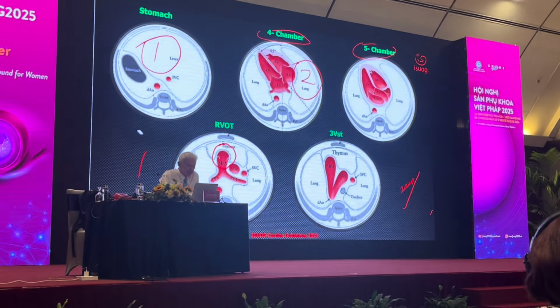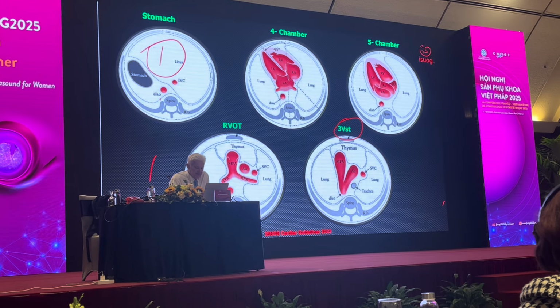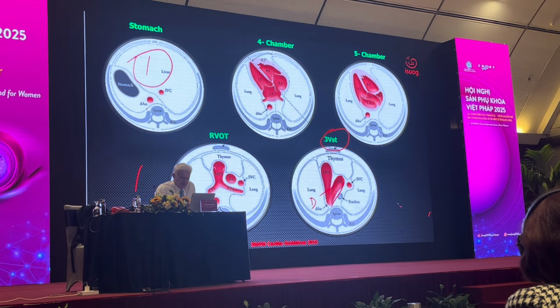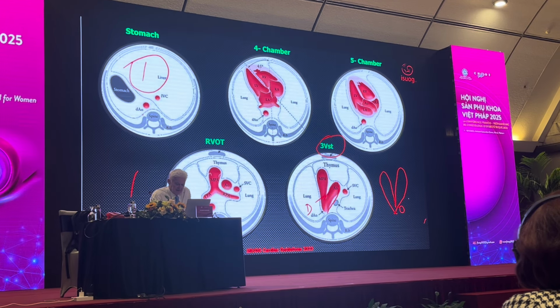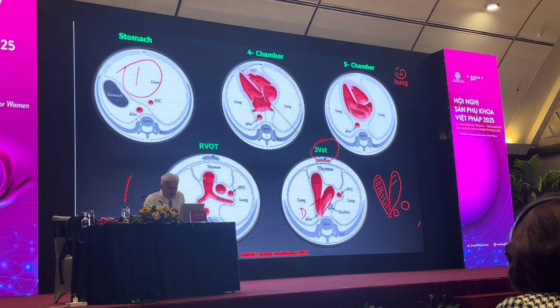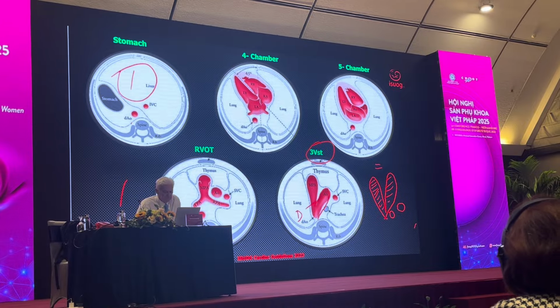And when you come to the last section of the heart, which is section number 5, it is the three-vessel tracheal view. What you're looking at is the main pulmonary artery, which continues as the duct and then joins the aorta. This is referred to as the V sign, the trachea and the SVC. At the level of the main pulmonary artery, the duct and the aorta, they are equal in size, high in the chest at the level of the three-vessel tracheal view.